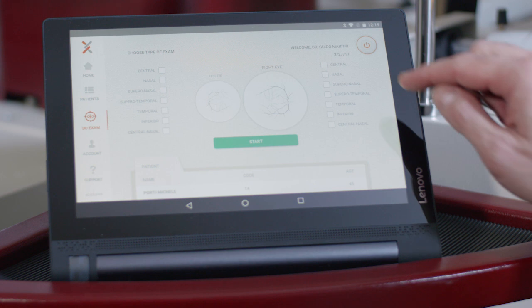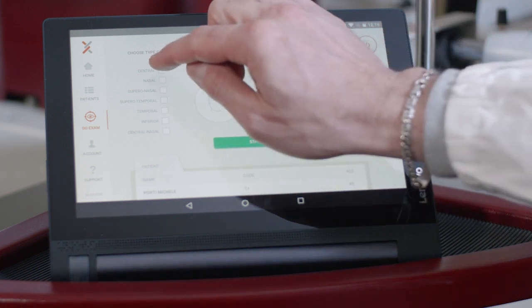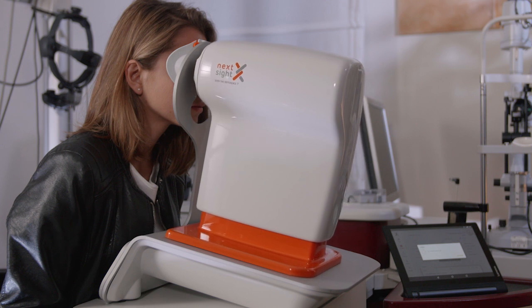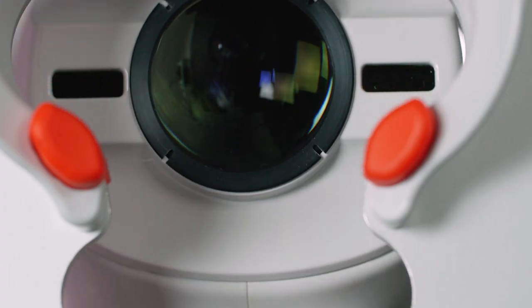At this stage, it is possible to select the required fields and which eye to examine. Nexi offers seven different internal fixation targets, which can be selected using the app.